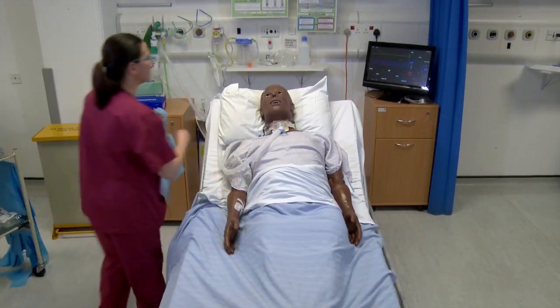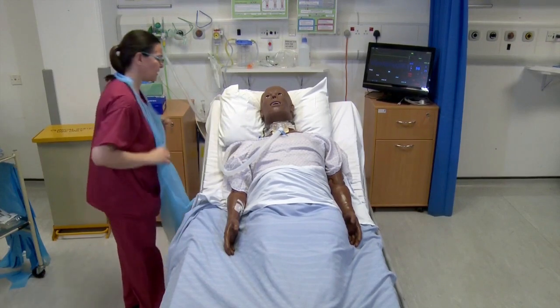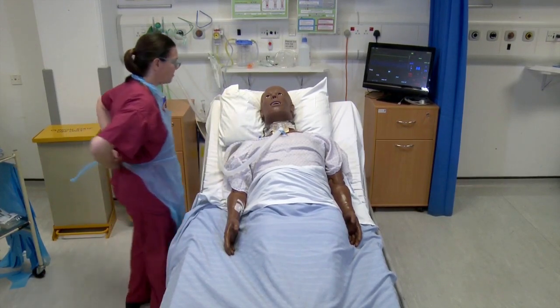Hi there, Robert. Your saturation alarms are going off. Let's have a look. Do you think you need a suction? Just popped you back to bed, haven't we?